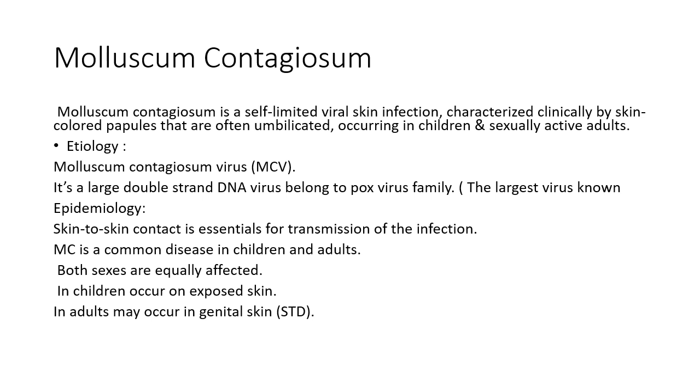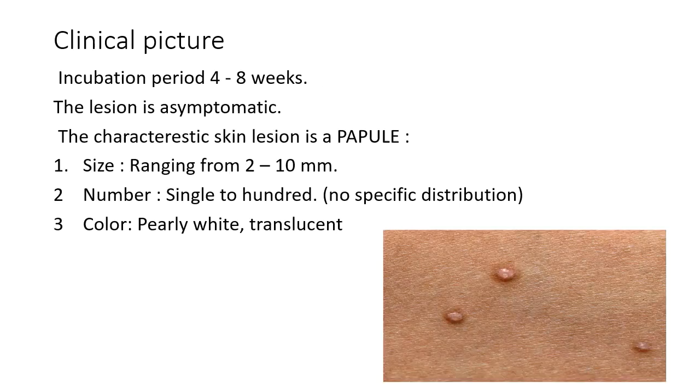Histologic features of Molluscum contagiosum are very characteristic. There is a cup-shaped lesion with inverted lobules of hyperplastic squamous epithelium, which expand into the underlying dermis. There are the Henderson-Patterson or molluscum bodies. These are very characteristic, up to 35 microns intracytoplasmic eosinophilic inclusion bodies. At the granular layer, the bodies become increasingly basophilic and occupy the entire cell. Chronic inflammatory infiltrate can be seen in regressing lesions or older lesions.